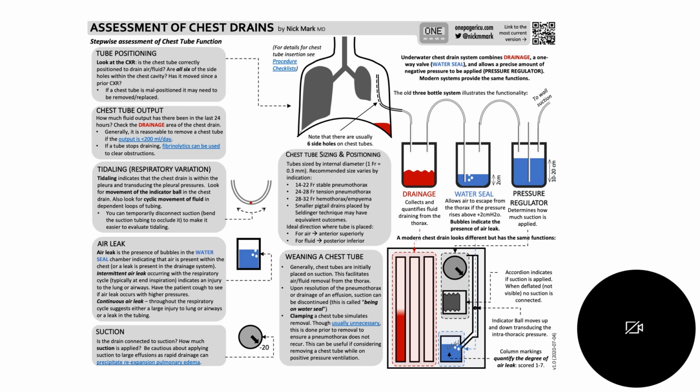Okay, and then this gives you some guidelines as to what to look for when you are assessing the patient with a chest tube: the positioning of the tube, what is tidaling, how you can tell that there's an air leak, and whether the suction is going as it should. And so this is just a little information for you.